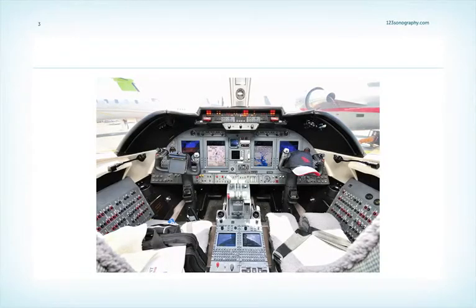The keyboard of your echo machine is like the cockpit of an airplane. And just like every airplane has a different cockpit, every machine has a different keyboard. But the general features of the keyboard are the same across the different ultrasound platforms. And even though some machines have 1,000 functions, some hidden behind touch screens and buttons and who knows what, in reality you will only be using a few. But one important advice, really get to know your machine. Talk to your application specialist and know which buttons and functions you have, because if you know how to use them, you will speed up the exam and you will also improve the quality of the exam.